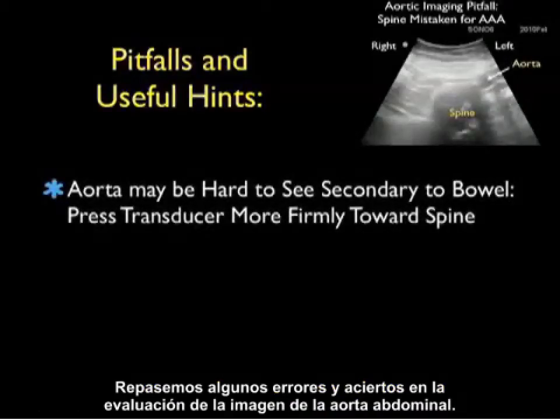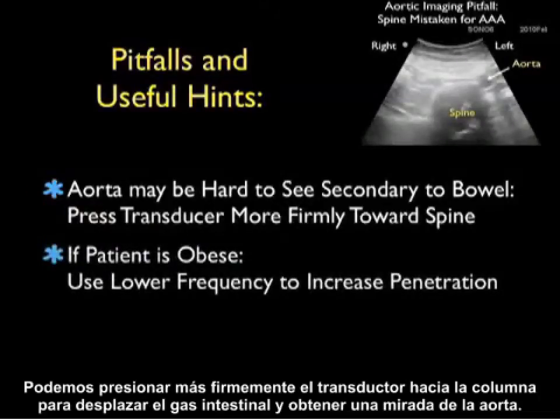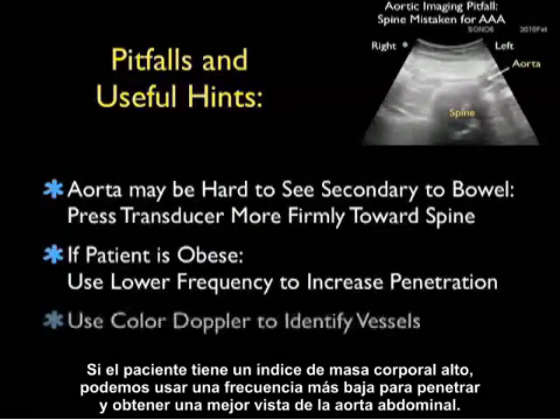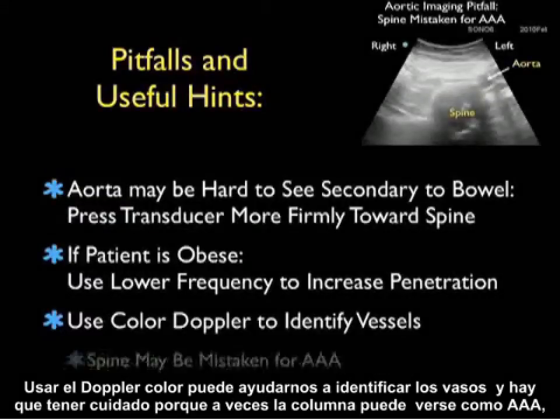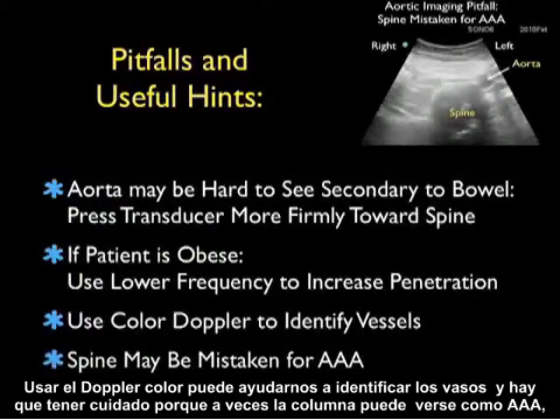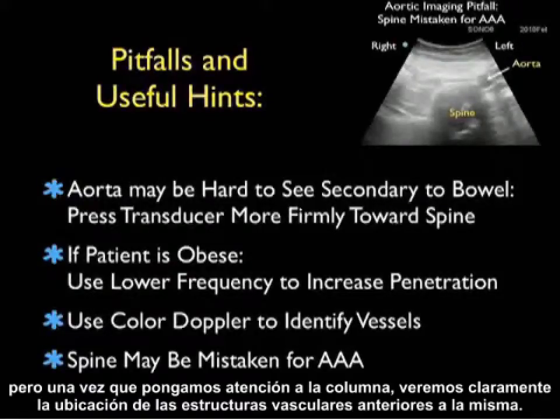Let's go over some pitfalls and useful hints for imaging the abdominal aorta. The aorta may be difficult to see secondary to excess bowel gas; pressing the transducer more firmly towards the spine can displace bowel gas and improve visualization. For patients with a high body mass index, use a lower frequency to increase penetration. Using color Doppler helps identify vessels. Be careful, because the spine can sometimes look like an AAA, but close attention to the spine location and anterior vascular structures will clarify this.